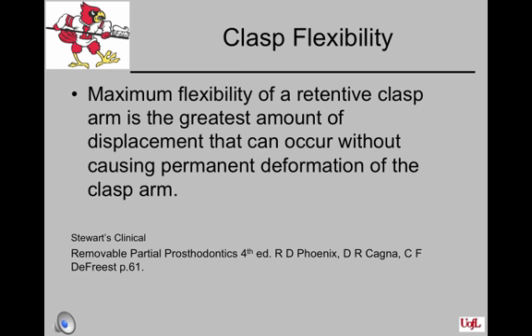It does so at a chosen path of insertion for the prosthesis that is determined by the dental surveyor. The direct retainer arm becomes passive when it is in its terminal position, with only the terminal 1/3 below the survey line. The direct retainer must meet these requirements, or retention is either not present or ineffective on the prosthesis.